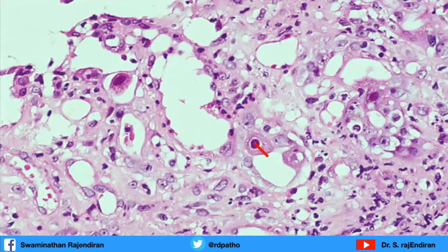You can all identify these beautiful inclusions, and some cytoplasmic inclusions also, nuclear and cytoplasmic inclusions. These are CMV infection, involving blood vessels. One hint for CMV: it affects mesenchymally derived cells first, endothelial cells and fibroblasts. Since it's involving the endothelial cells, it produces vasculitis and ischemia, and that's why most CMV enteritis or CMV gastroenteropathy is associated with ischemic changes because of the overlapping vasculitis. Here it is involving more epithelium, whereas here it's involving more endothelium.